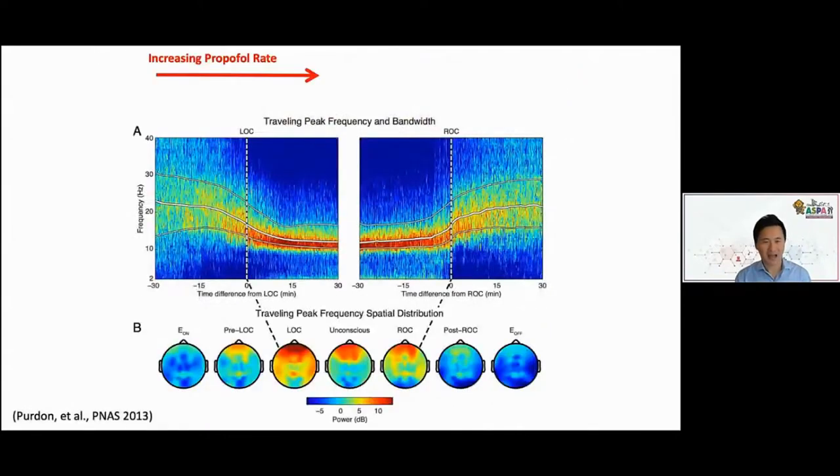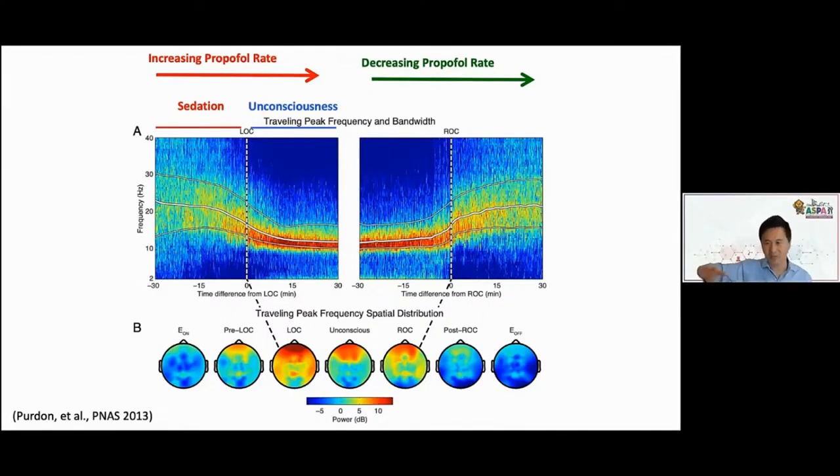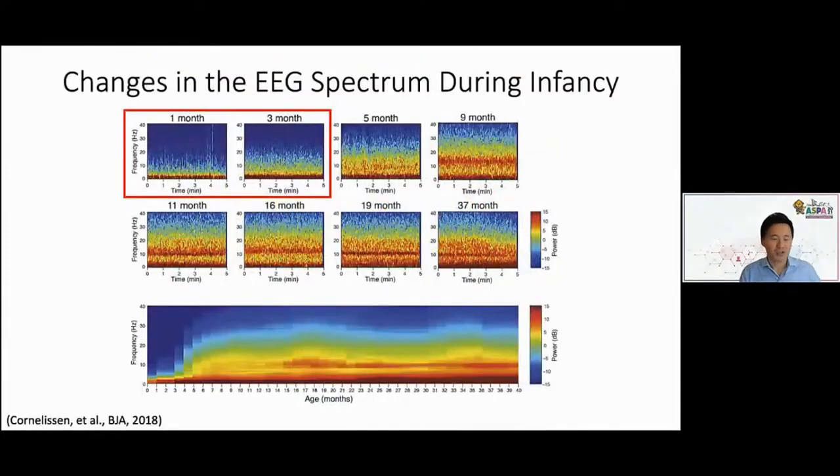And again, that changing alpha wave allows us to maybe very precisely titrate the anesthetic drugs, avoiding periods of emergence, but also allowing the child to emerge at the time when we need them to, and preventing oversedation, say by preventing entering into burst suppression. So then the question comes up, what do we do for the children, say less than 6 months of age, who don't have that pronounced alpha wave?